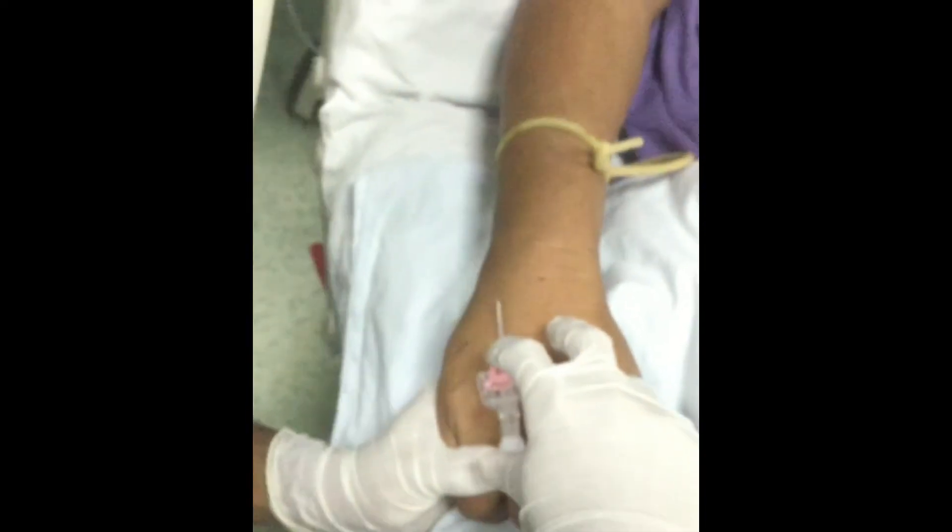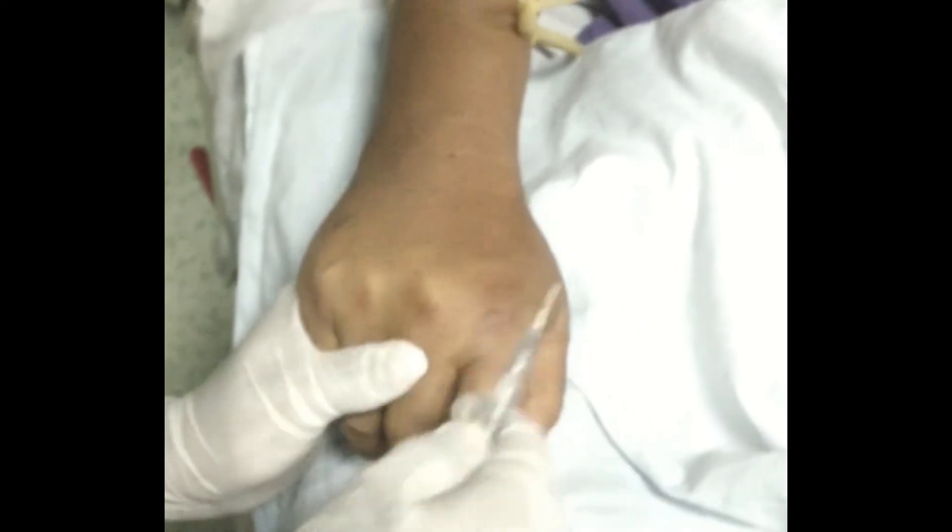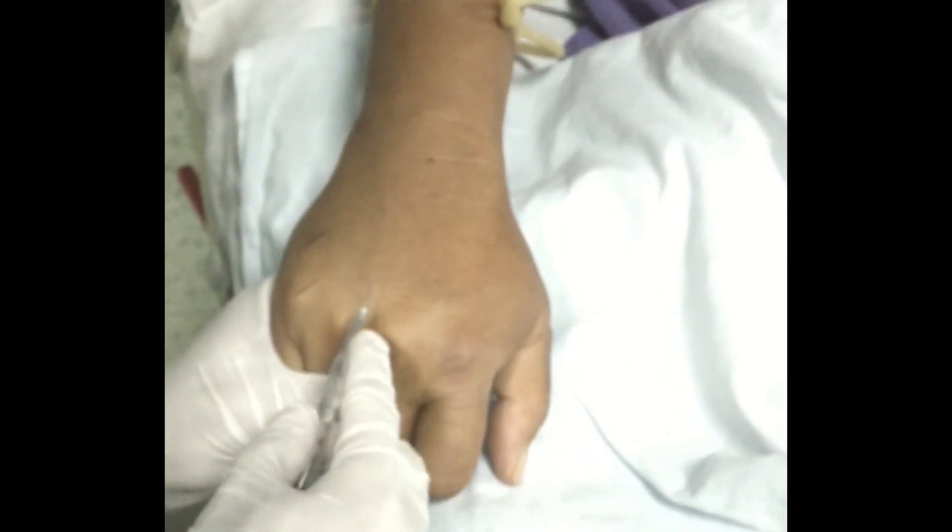Measure the size of the vein. If needed, inject 0.1 to 0.2 ml of 1% lignocaine locally to the site.